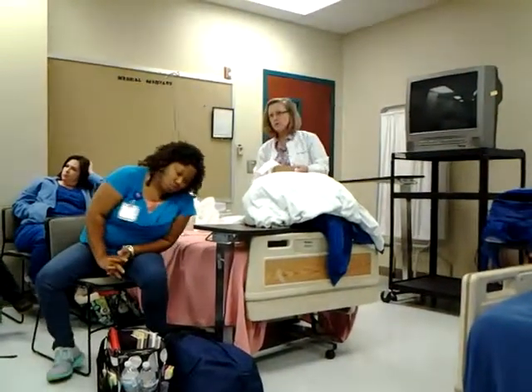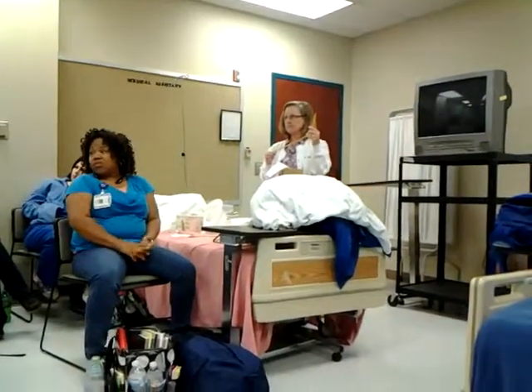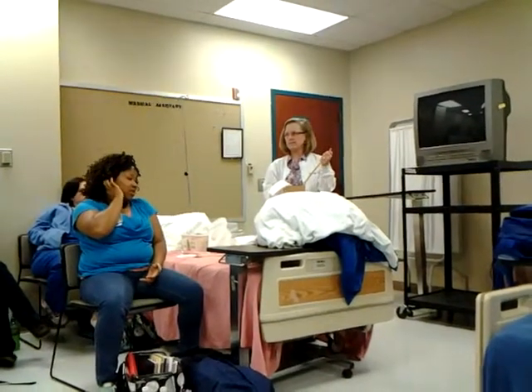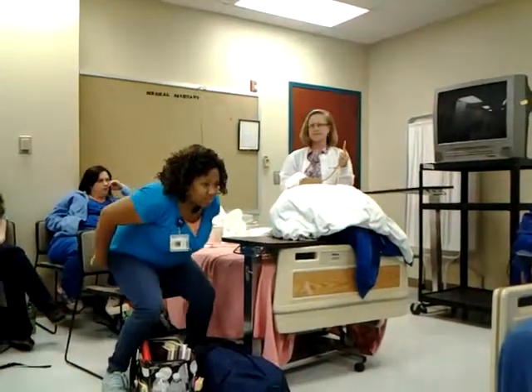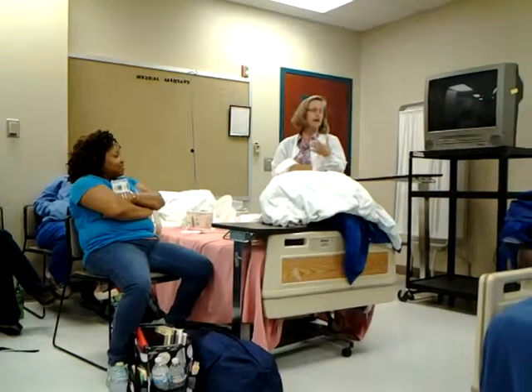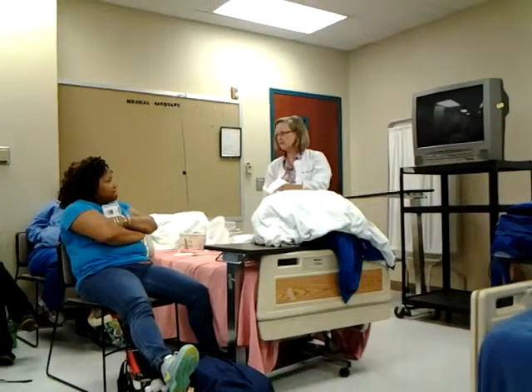Do you feel like you understand a little better what we're putting into the patient? What I'd like to do now is show you on the mannequin exactly what we expect of you in your checkoff.